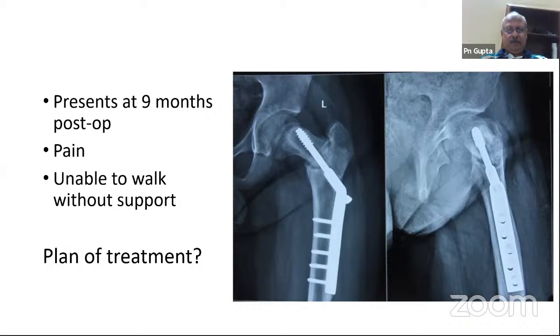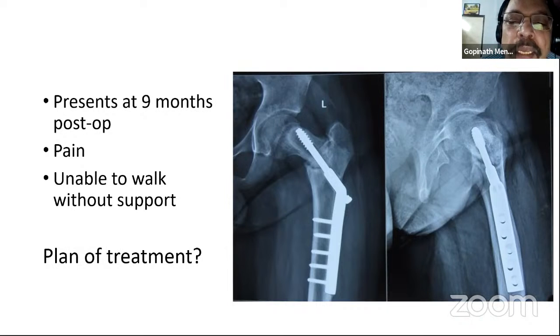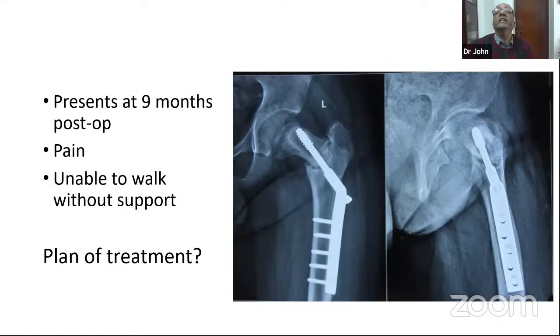Okay. John, I'm just wondering, why did this implant fail so much? There's so much loosening around the screw site. Is there any metabolic problem with the child? So we did investigate that. His vitamin D was okay. No thyroid issues. And as you will see later, a fairly normal-looking child. We did investigate that because that's something you need to watch out for, especially in India. Vitamin D deficiency is very common, and thyroid is another thing that you need to look at. Okay, so excellent.